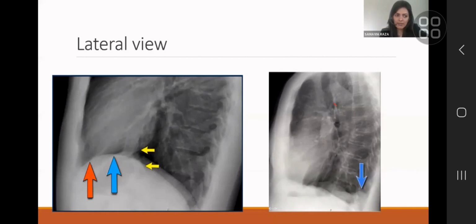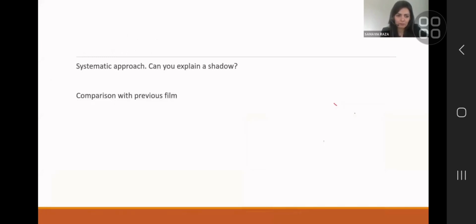Unfortunately, as time goes on, we are less and less interested in chest X-rays, and that's a route to over-requesting cross-sectional imaging. So it's a vicious cycle we are in. A lot of pathology that we pick up on chest X-ray is actually normal variation of a normal person. So when you go to an exam setting or a course setting, it suddenly becomes very hard to report a simple X-ray.